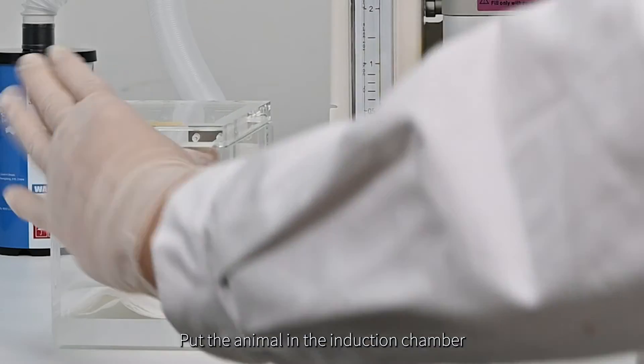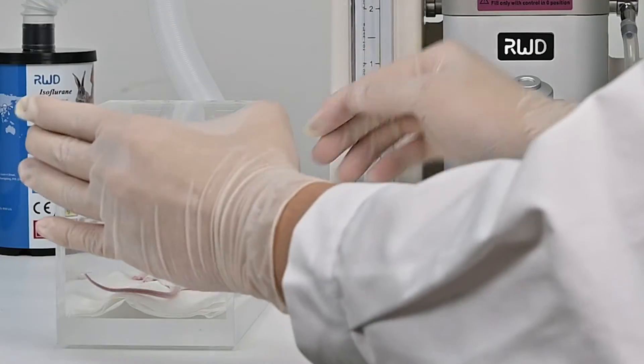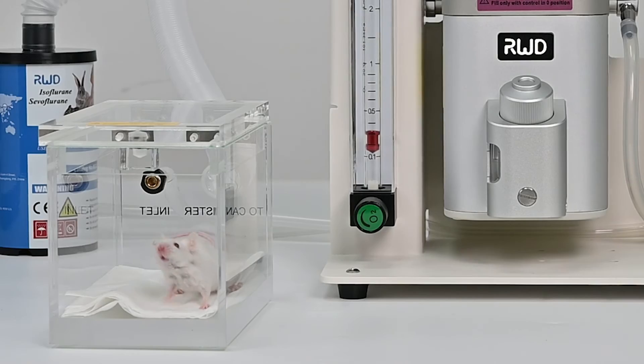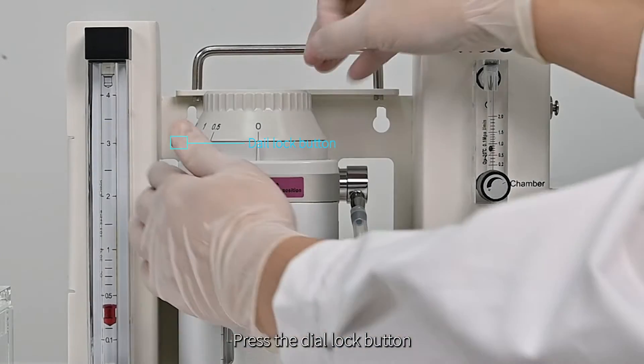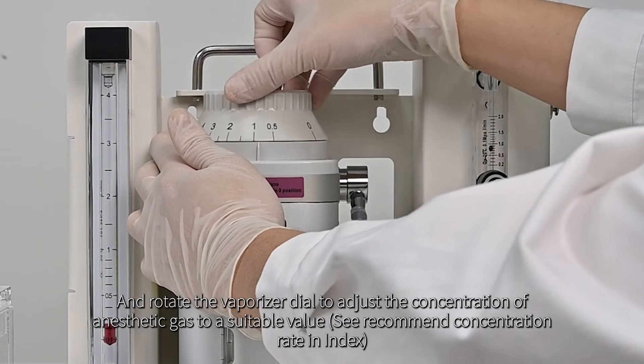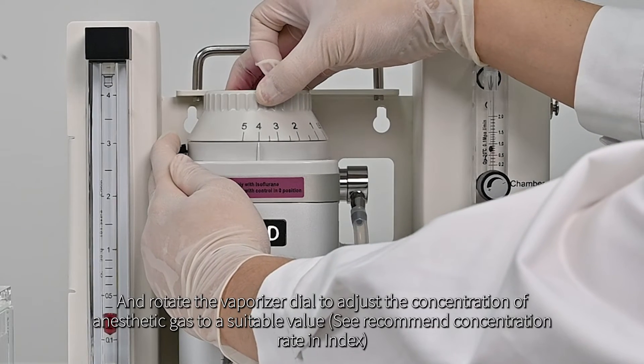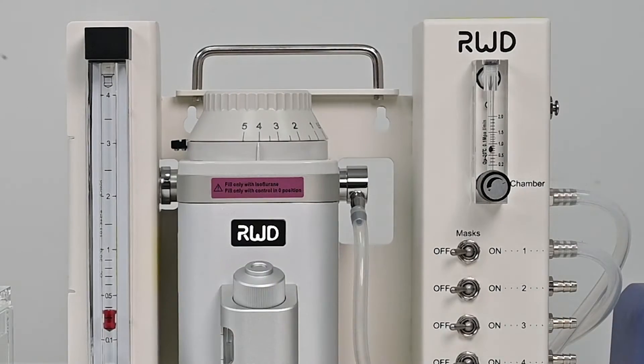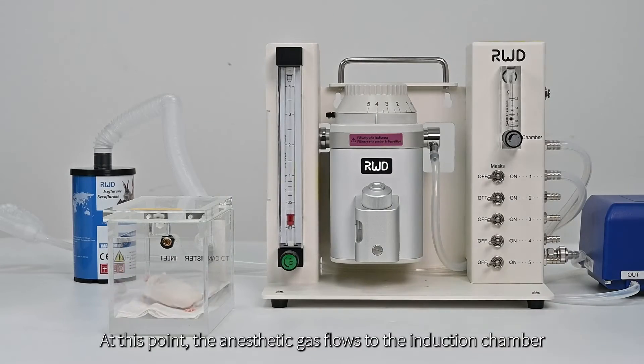Put the animal in the induction chamber. Press the dial lock button and rotate the vaporizer dial to adjust the concentration of anesthetic gas to a suitable value. At this point, the anesthetic gas flows to the induction chamber.